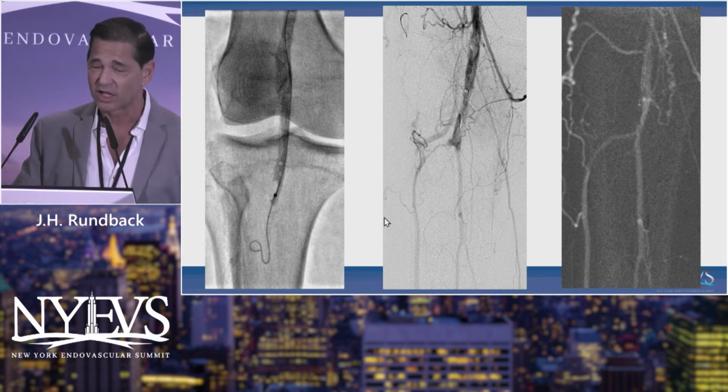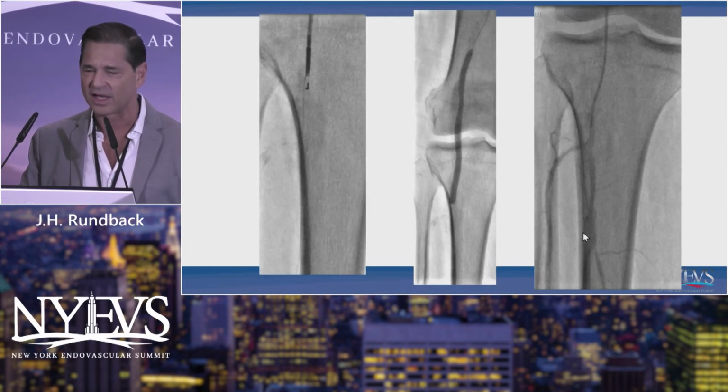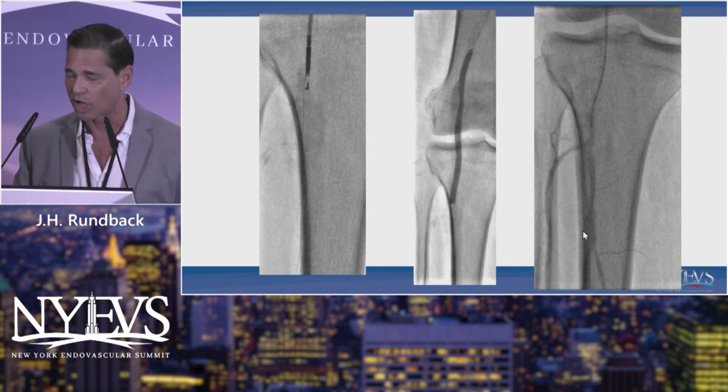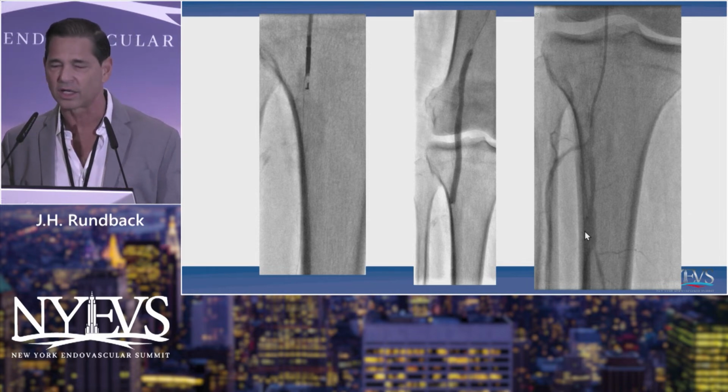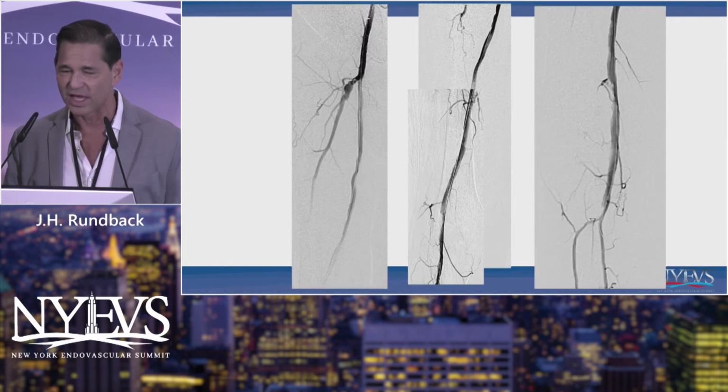In this case, we kind of thought we had it. Then we get down. We have some angiographic sort of dead end over here. So despite my most recent advice, we were able to sort of get down here, target towards what is now the true lumen. I was a little bit surprised by this wire hitting that angiographic dead end, and then of course re-enter. And of course, using the L and T configuration to make sure you align appropriately with the target lumen. Once we complete that, then we can sort of balloon this appropriately now and finish up your case as you see with the result here.